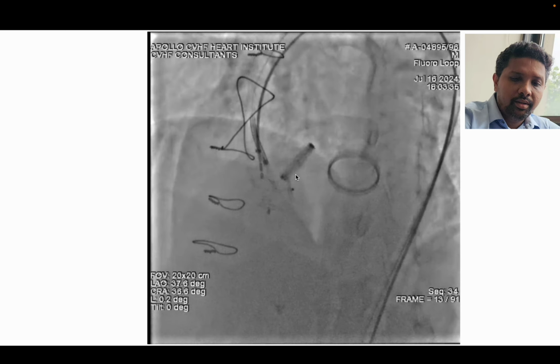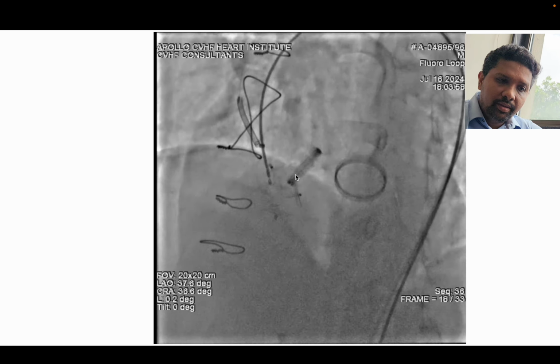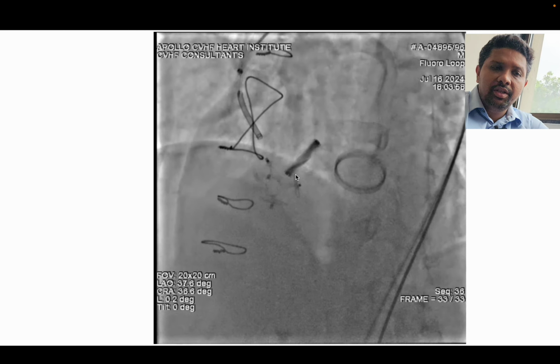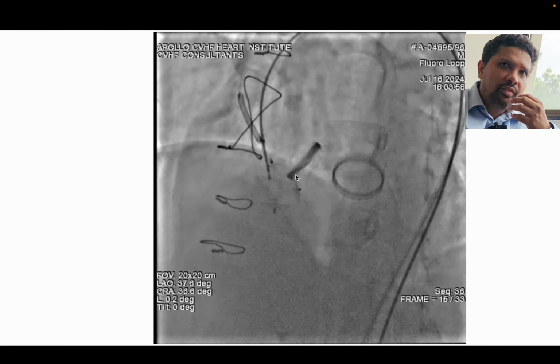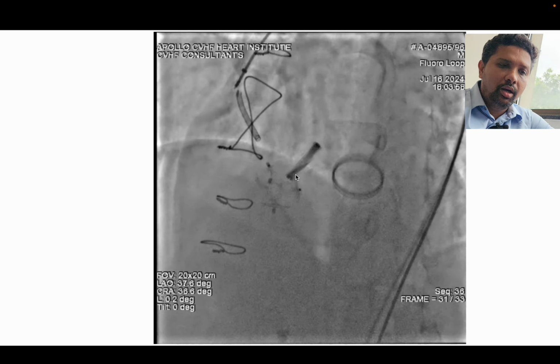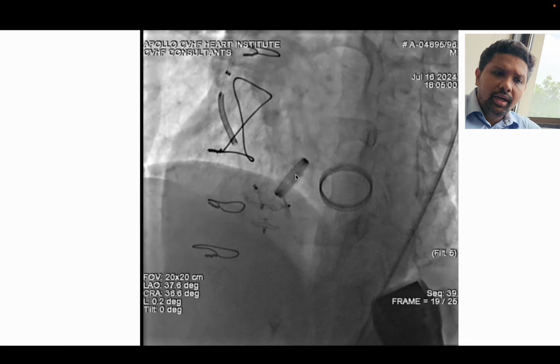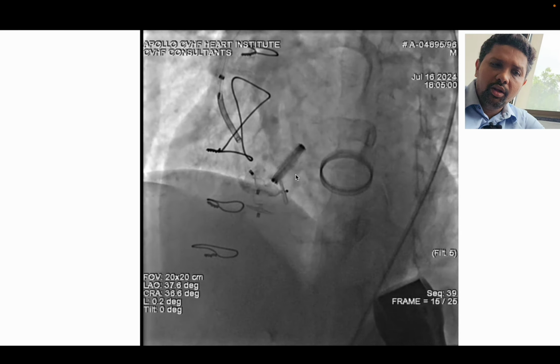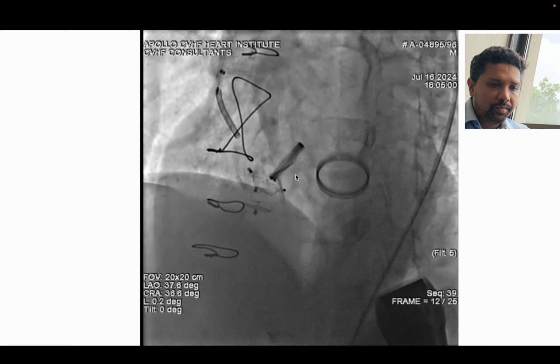It is remaining stable. Now I deployed the Konar MF device. It is also remaining stable, but in the process you can see that it has dipped down a bit. That was eventually going to happen. That is what happens with the nitinol devices. Both these devices do not have a lot of fabric in them, and as a result there will be some paravalvular leak around it, which we saw in the last shoot. We have accepted that, and I feel that eventually over a period of 1 to 2 months there will be formation of clot in the devices, and this leak will completely stop.